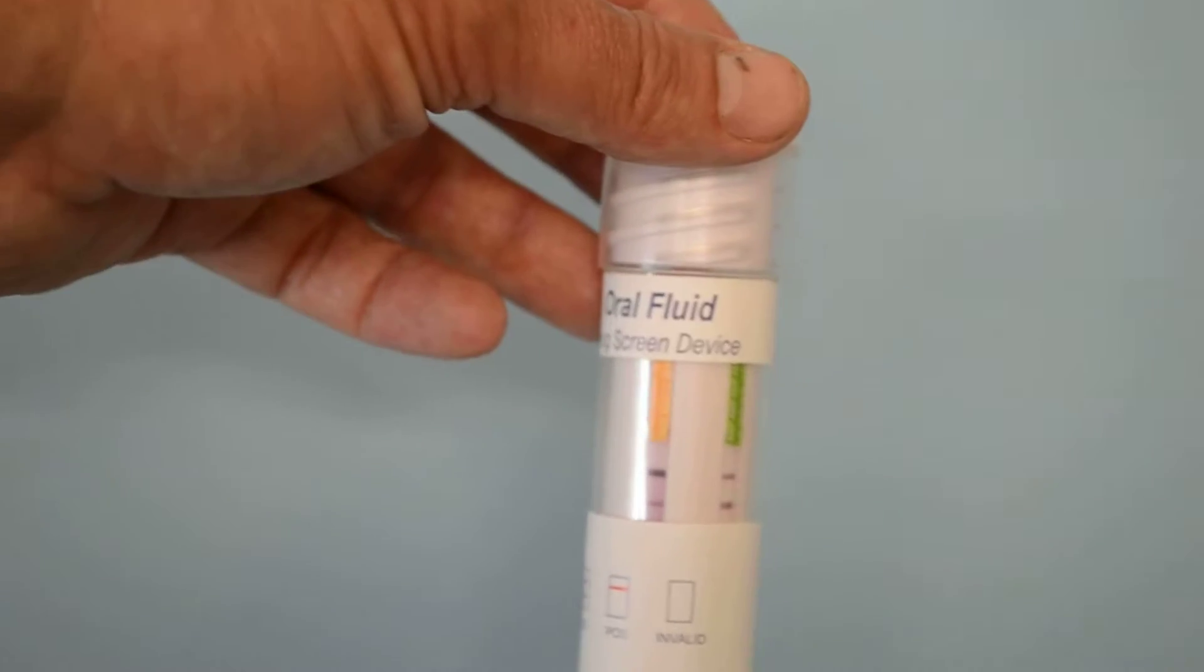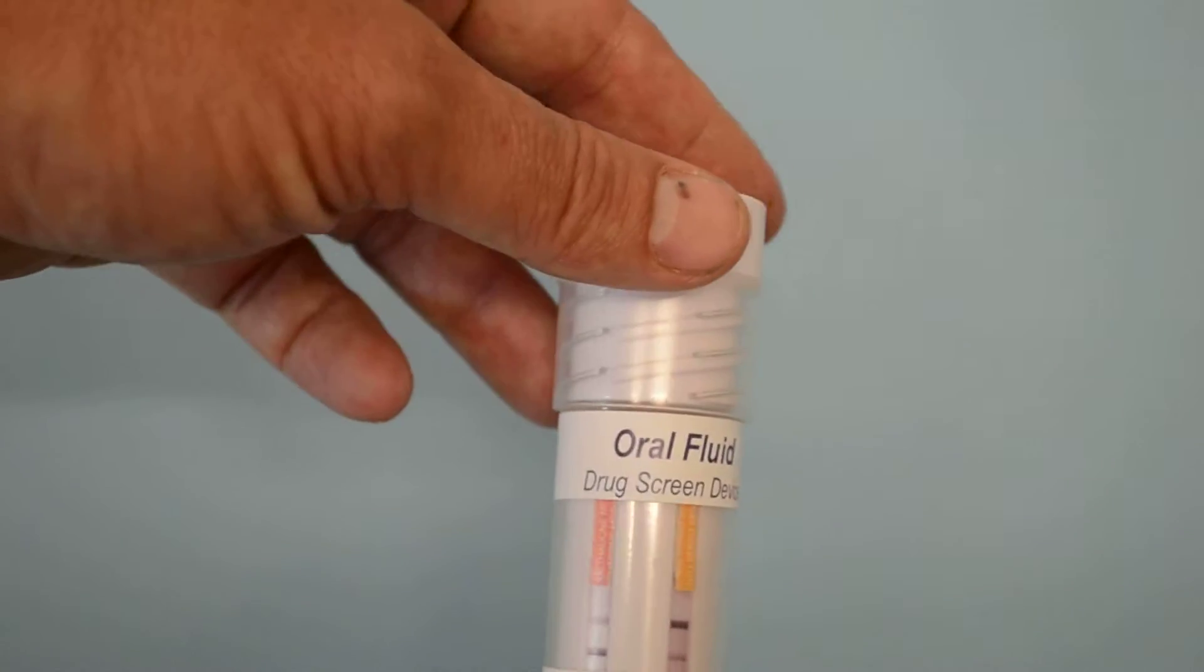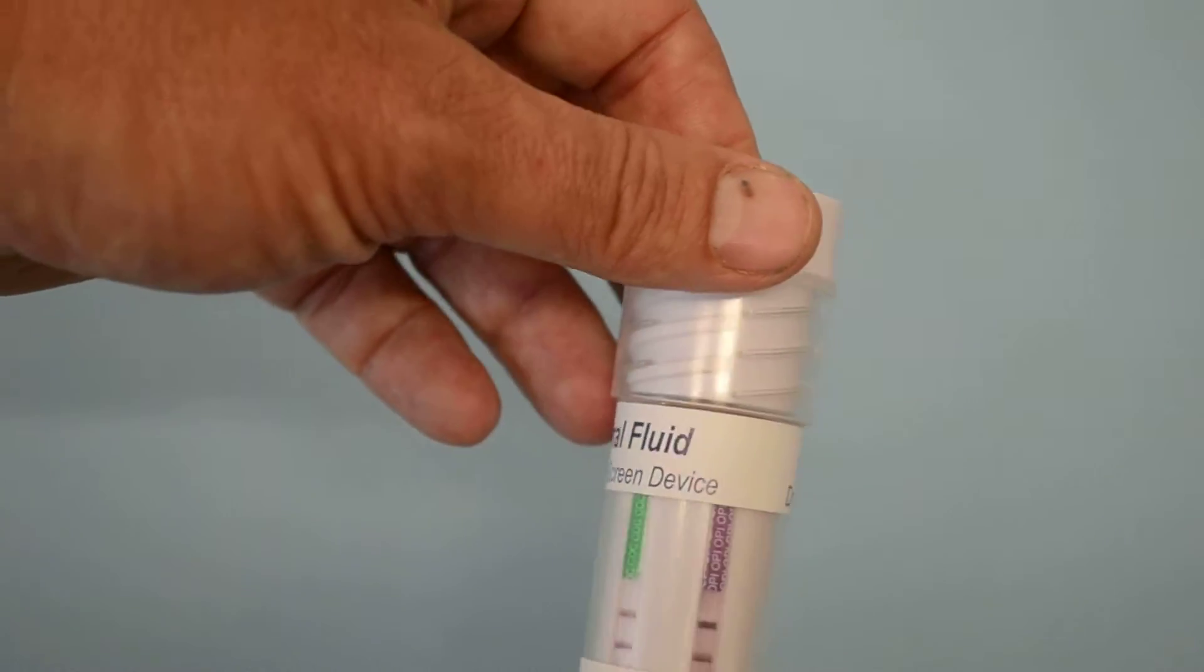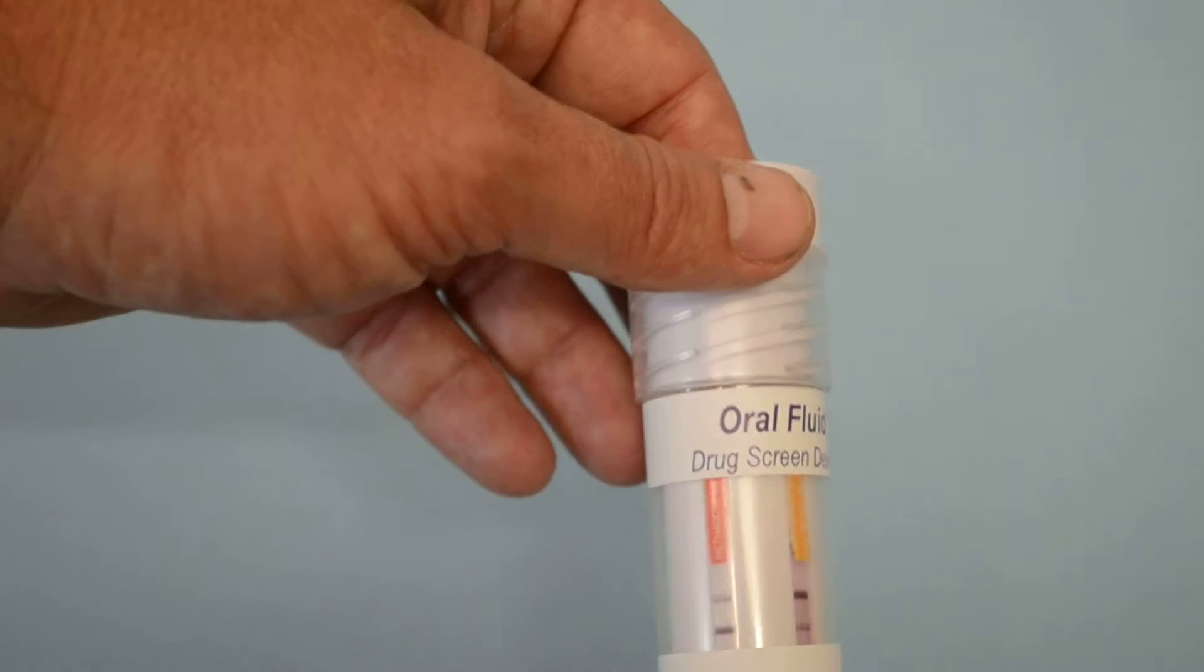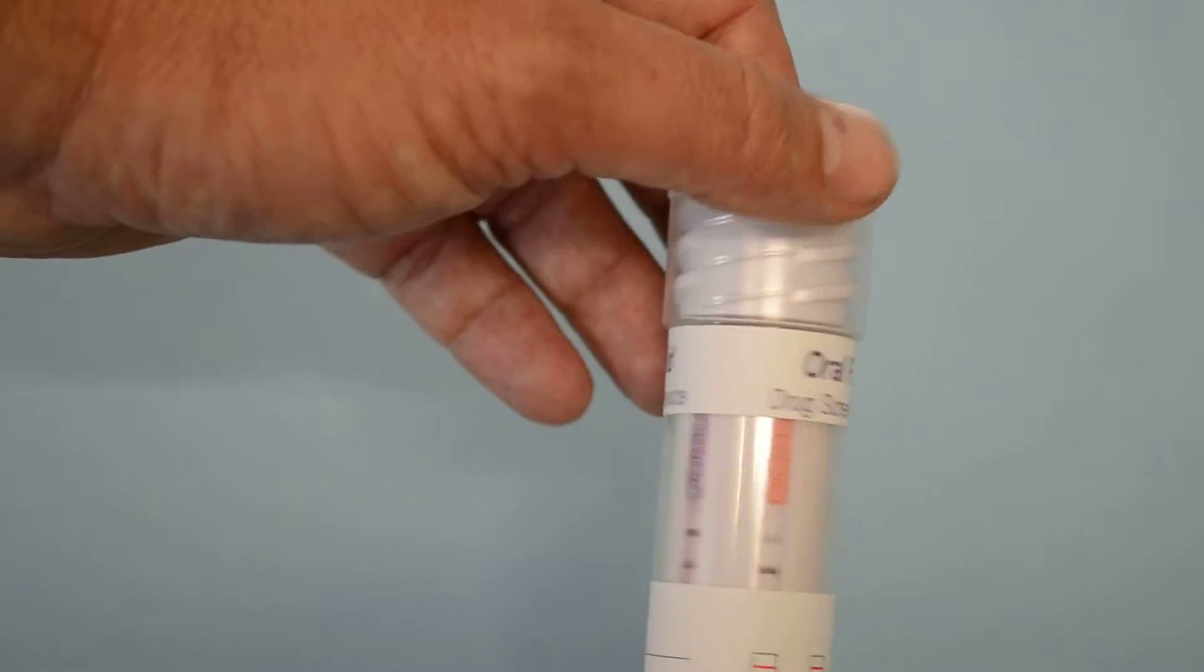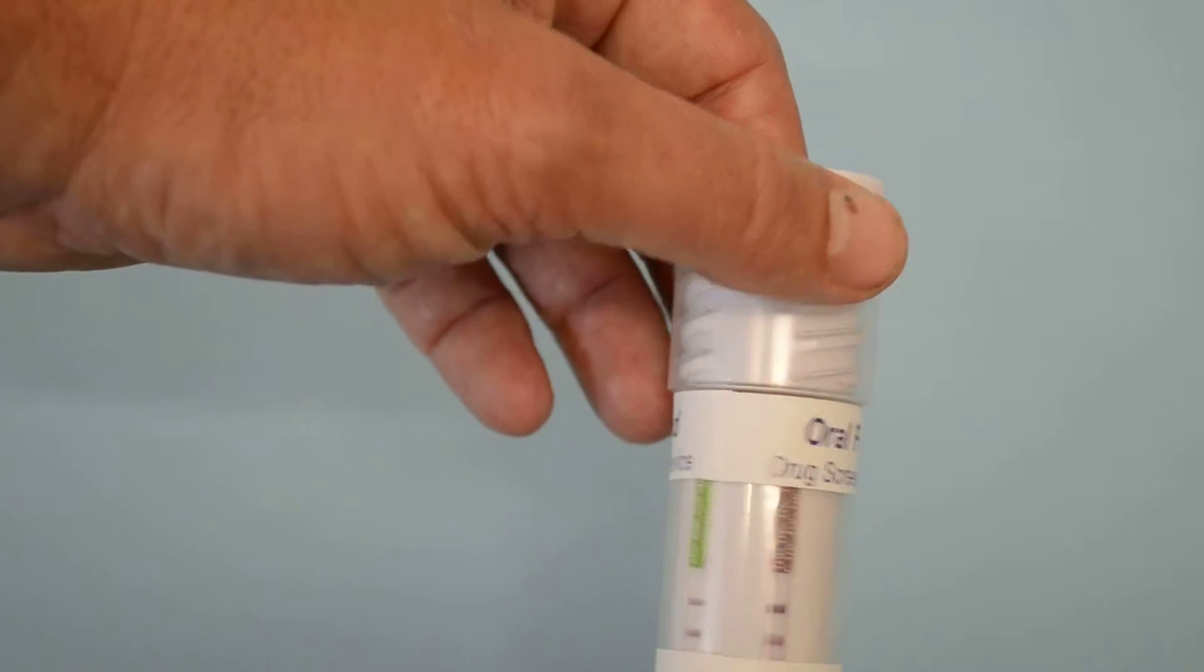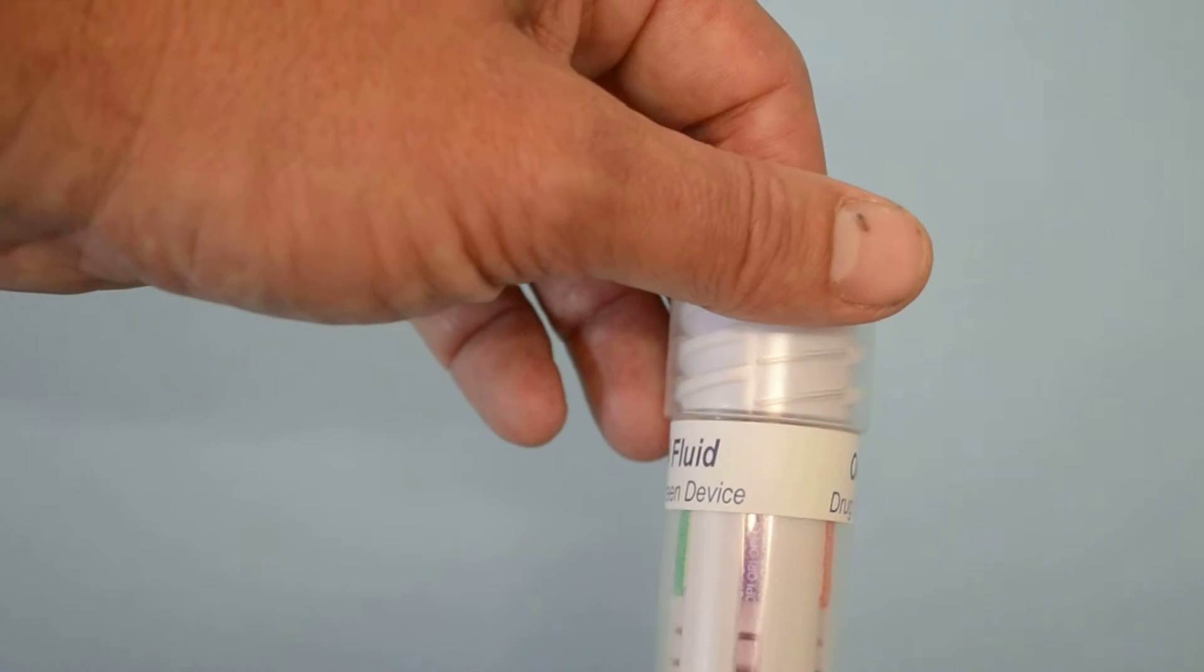Now we're going to demonstrate the results, reading this at between five and ten minutes. We've got all the control lines showing on this test. We've got clear test lines showing on all six membranes, so these are all negative results.